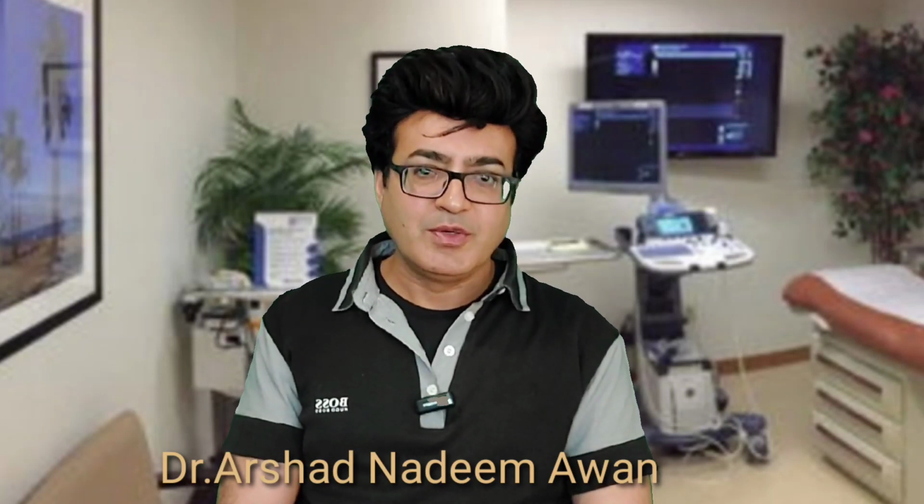Today my topic of discussion is related to thyroid categories. For the classification of the thyroid nodule, the U system is proposed by the UK radiologists and by the British Thyroid Association, that is BTA. So they propose the U classification, which confirms whether the thyroid nodule is benign.